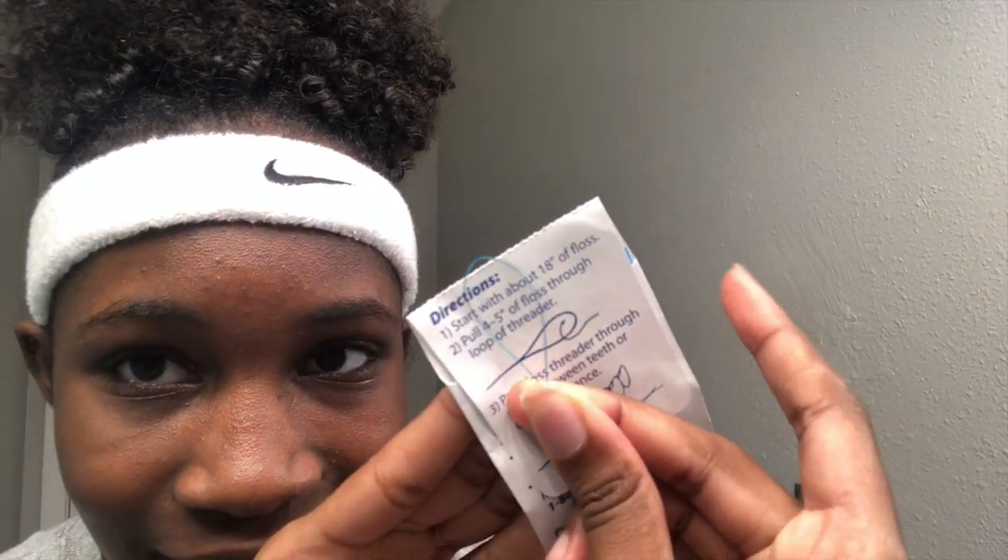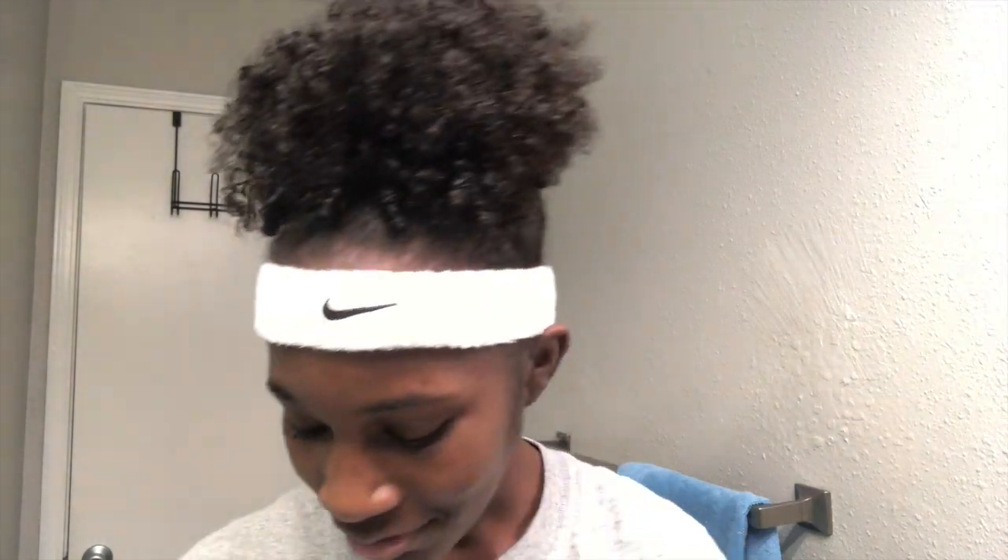Now I go in with the regular floss. I discovered that the floss they gave me at the dentist is too thick and that's why it hurts so bad — it's like almost like a thin piece of yarn. But this is what I'm gonna be using. Can't really even see it, but yeah, that's what I'm gonna be using — with the floss.